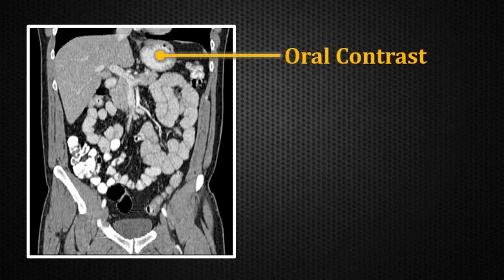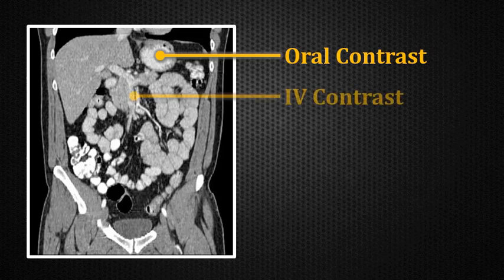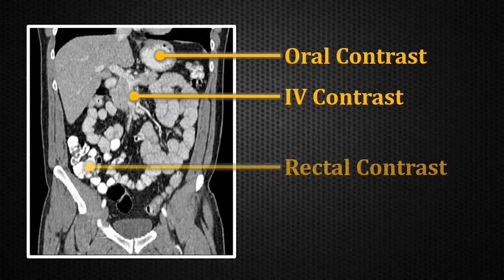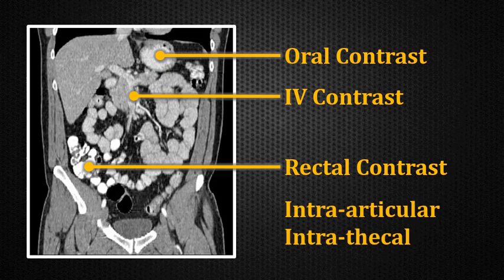This particular patient has received contrast in several different ways. We see contrast inside of the stomach, which means the patient received oral contrast. We can also see contrast in the small bowel, again indicating oral contrast. We can also see contrast in the blood vessels of the portal system, confirming that the patient received intravenous or IV contrast. This patient also shows very dense contrast in the descending colon and in the rectum, meaning the patient has also had rectal contrast. Other routes include intraarticular contrast — meaning in the joint — and intrathecal contrast, meaning in the spinal canal.